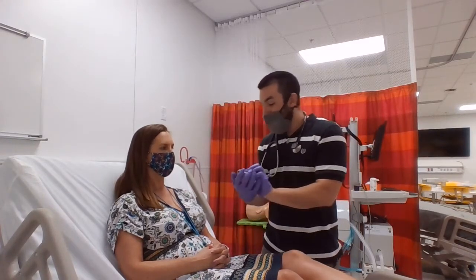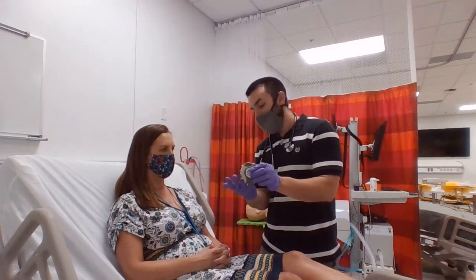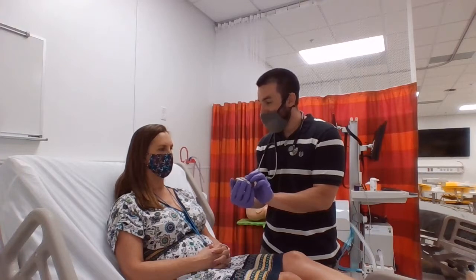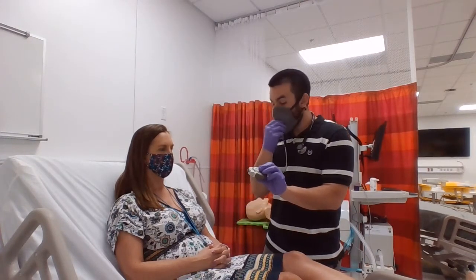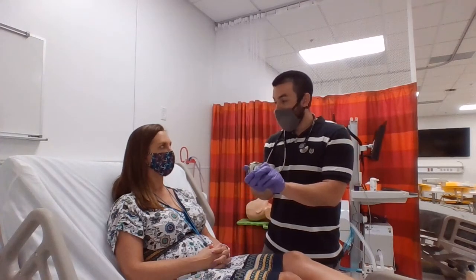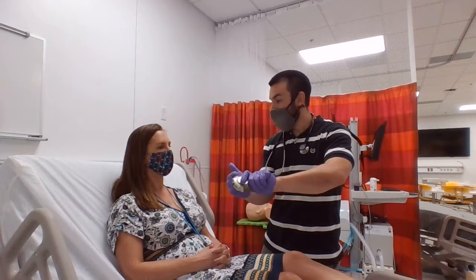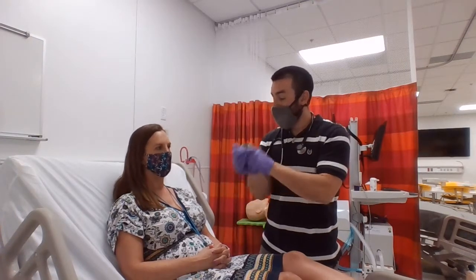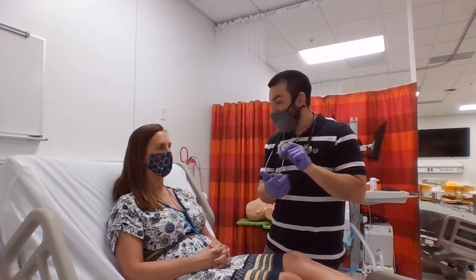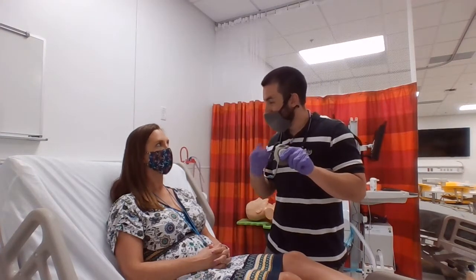However, once we get ready to actually do this, and I've broken these things in half for fun sometimes, there's a bunch of little individual doses of medicine inside of here. And this little lever, as you push that back, is going to puncture a dose, and there's a little dry powder sitting inside of there. I'm going to load this dose for you. But because it's a dry powder, once we pull that back and that mouthpiece opens up, you can't tip it upside down. You want to either hold it upright or at an angle like this at the very most. Likewise, with that other device I showed you, you could blow into it with a one-way valve. This thing, if you blow into it once we open it, it's going to scatter the powder, and you're not going to get your medication.